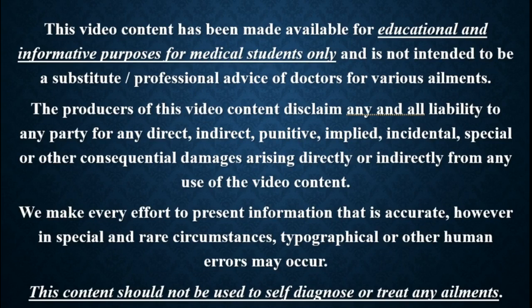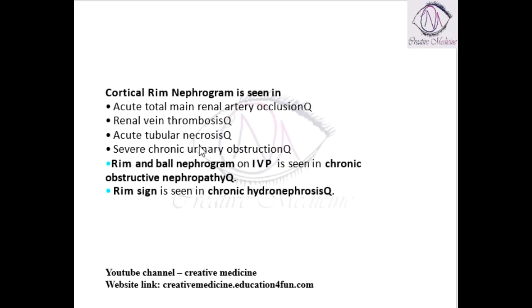In this lecture, we will learn about cortical rim nephrogram. There are different types of nephrogram. What is a nephrogram? Nephrogram is the image of the kidney.